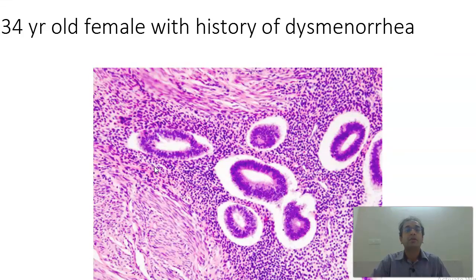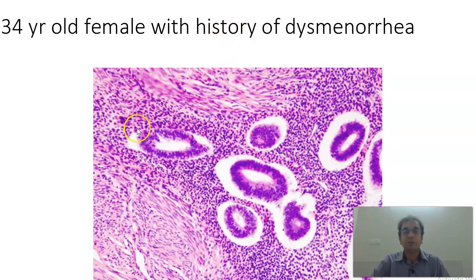Coming to a 34-year-old female with history of dysmenorrhea. What I see in this slide is that there is myometrial tissue within which there are islands of endometrial tissue. This becomes adenomyosis. Adenomyosis is when there are foci of endometrial glands and stroma within the myometrium.